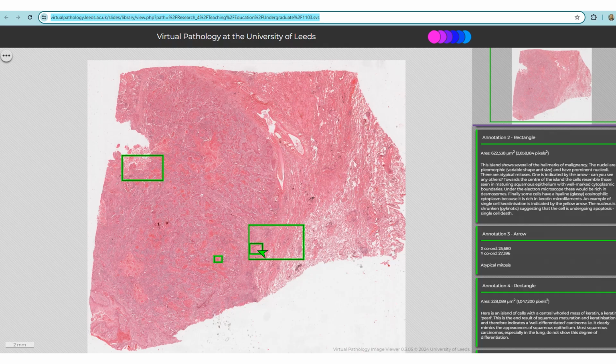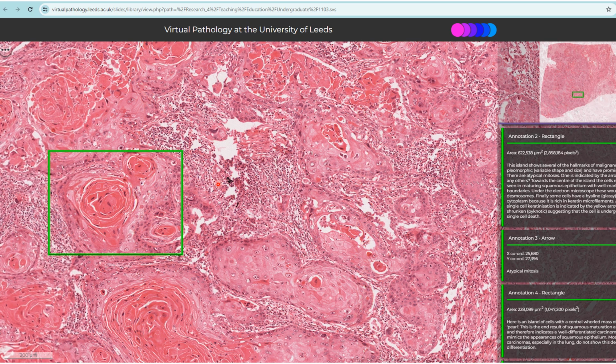The next one is lung squamous cell carcinoma. This is a guided slide. You can click at the location to look into the slide, but the two most important findings are a peculiar feature of squamous cell carcinoma, which is the keratin pearl. This is what we call a keratin pearl. This is also another keratin pearl, and these are the malignant squamous cells, having all five features of malignancy such as pleomorphism, high NC ratio, mitosis, as well as necrosis. All right, that's all. Thank you.